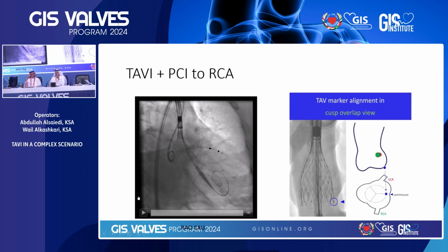He will give you the normal dot shape in each view to make sure that you have good commissural alignment, in addition to what you know from the hat marker. Like in cusp overlap, it has to be in your face, and when you go up, it needs to be in the greater curvature. Now he will show another trick to make sure you have commissural alignment. If you don't have it, pull it out, recapture, go in the descending aorta, and go back after you do a good three o'clock rotation. These are additional important things, especially in this patient with underlying stenosis of the left main.